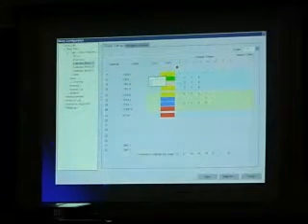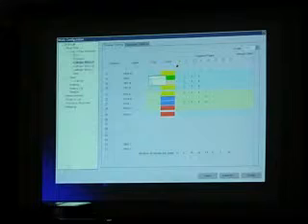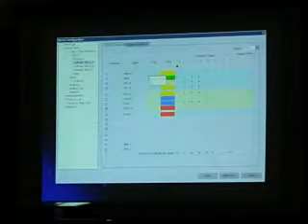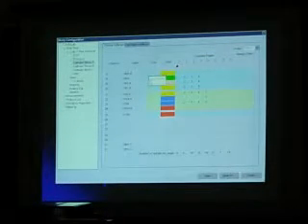So you've got your standard HIS tracing, right? And these tops and bottoms are covering up my other signals, okay? So I can clip them. Instead of changing this and making this smaller, and now I can't see my HIS, I can clip them. And all that does is cut off the tops and the bottoms. See what I mean? And because we care about timing and not morphology, I can do that, and it's still legal. Does that make sense?